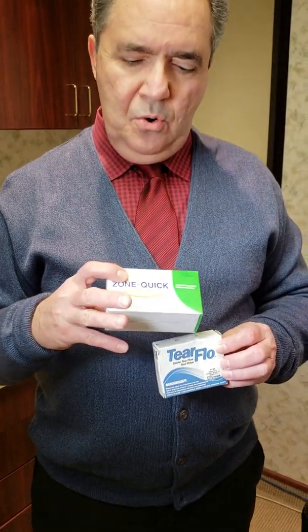Today we're going to show you how we measure aqueous deficient dry eye with two different tests. One's called ZoneQuick and the other one is called Schirmer's. I'm going to go over how we test this, so you'll know when you see your doctor whether they're actually measuring if you're deficient in the aqueous or liquid layer, or the oily layer.